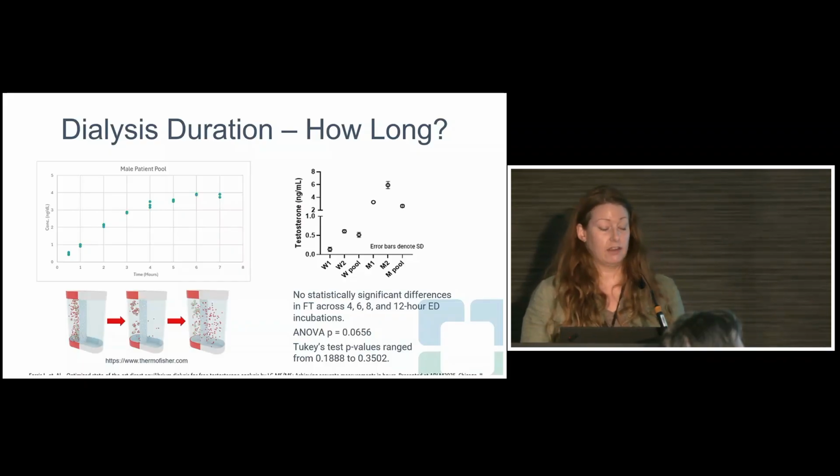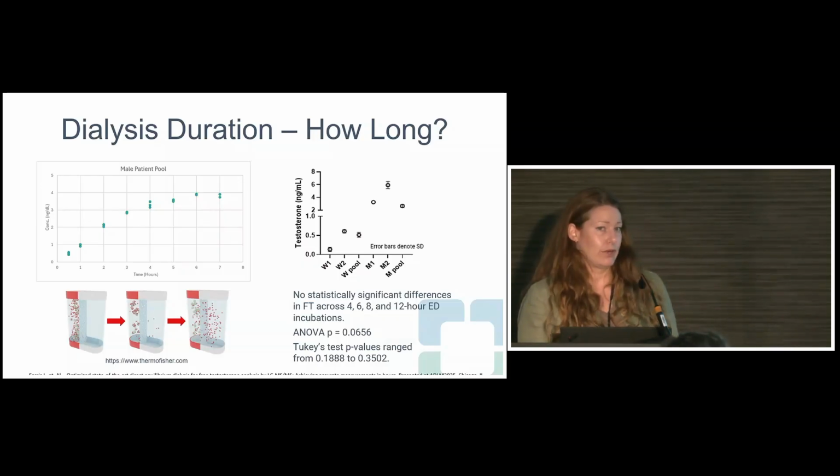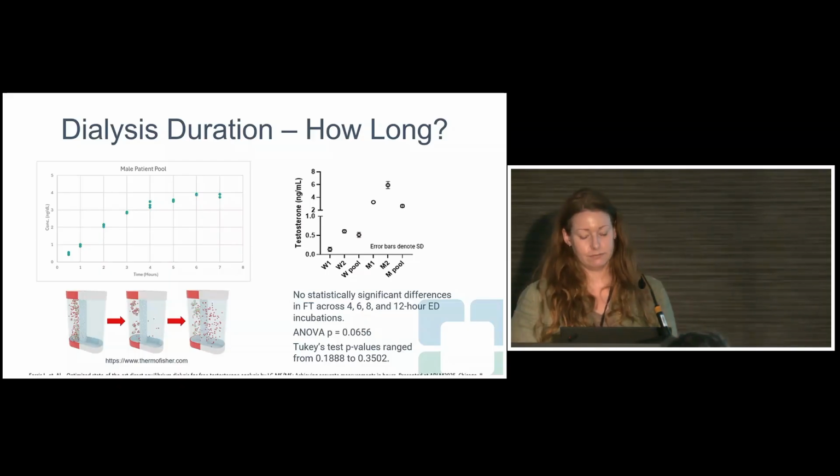Timelines and things like that. If you're going to take your dialysate samples earlier, when there's a higher rate of change, you're going to have to hit that time point a lot more. I would say it's a very rigid time point. Taking it at the 8 hours gave our techs a little bit of a buffer, so they don't have to feel so pressured to start pulling samples at a certain time.